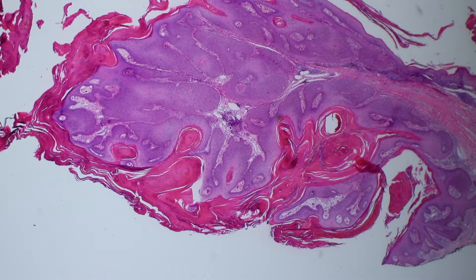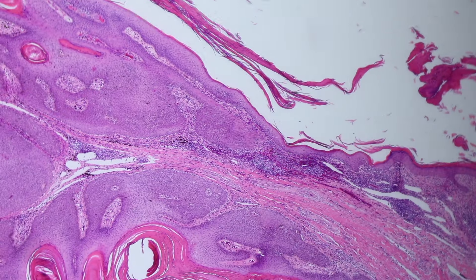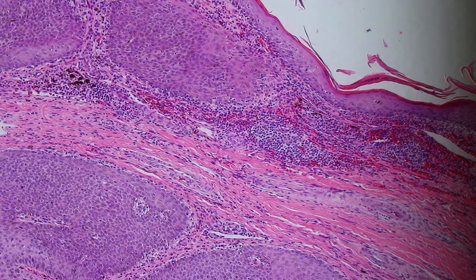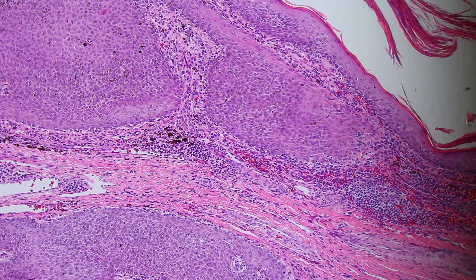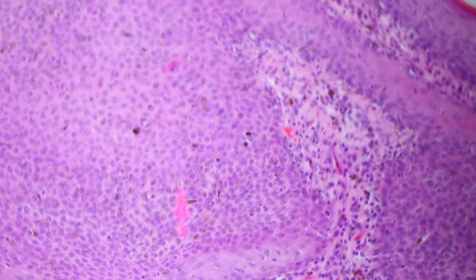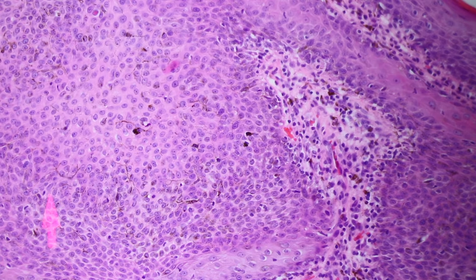This one is very irritated and inflamed, with an area that has a lot of lymphocytes and inflammation. Sometimes these lesions get really inflamed and can mimic squamous carcinoma clinically. Look at all that pigment — not only is pigment in the keratinocytes, but there are also these little branchy dendritic cells.